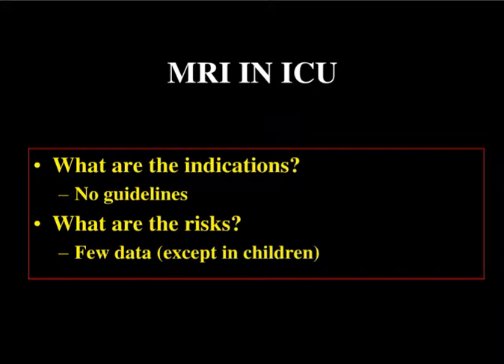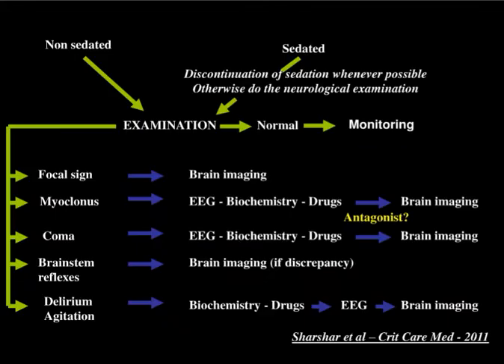Yeah, I tried to find guidelines and didn't find any. Maybe the purpose of this meeting is to give guidelines on when to do an MRI and what the risks are of doing an MRI. There are very few data, and most of the time in children. So in our center we tried to define the indications for doing an MRI in our medical ICU patients.